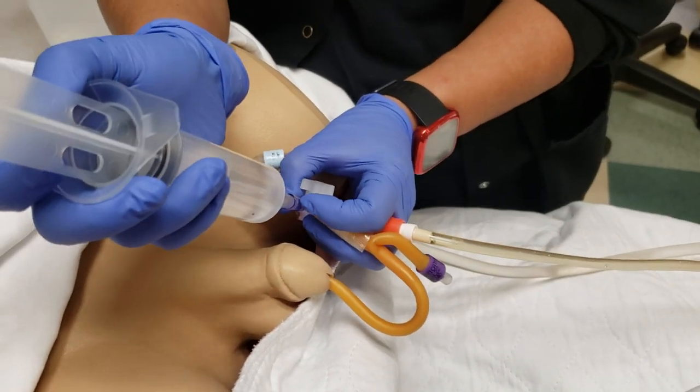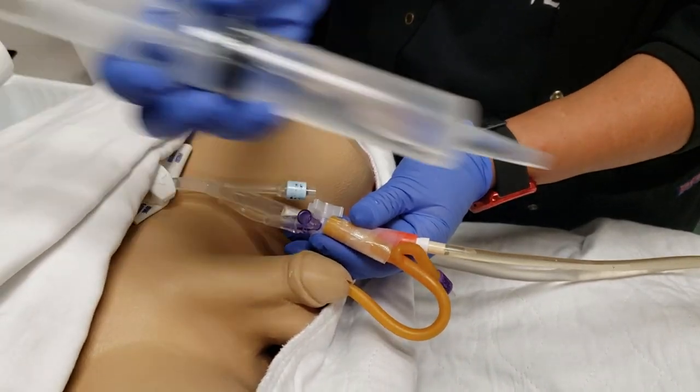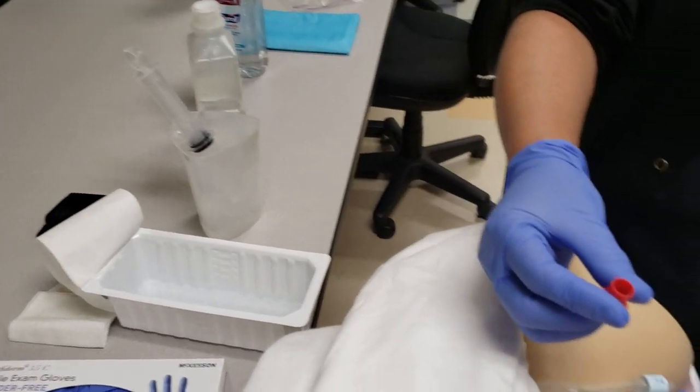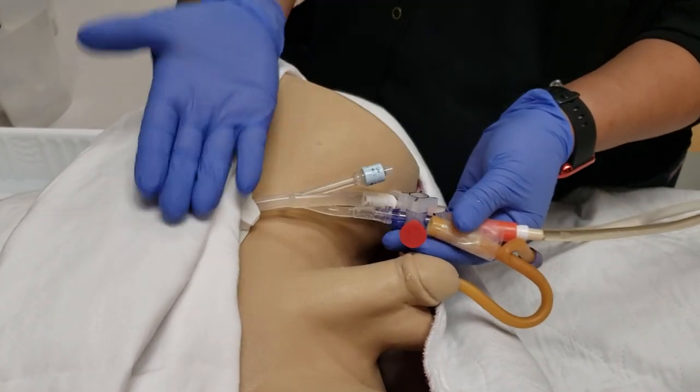Once you're getting a good flow, remove the syringe, place the cap back on the access port, and that's it.